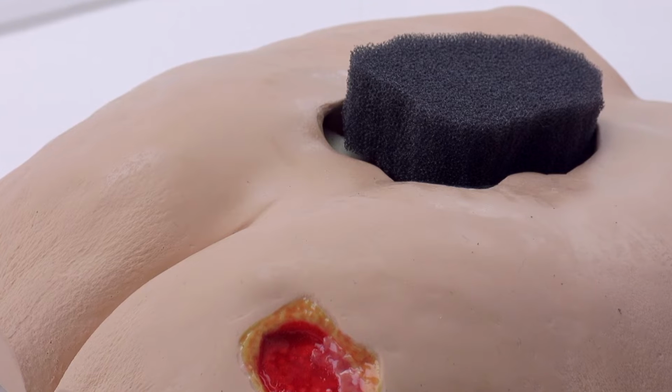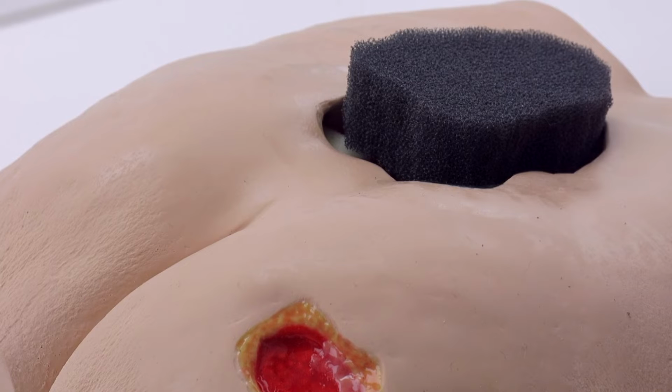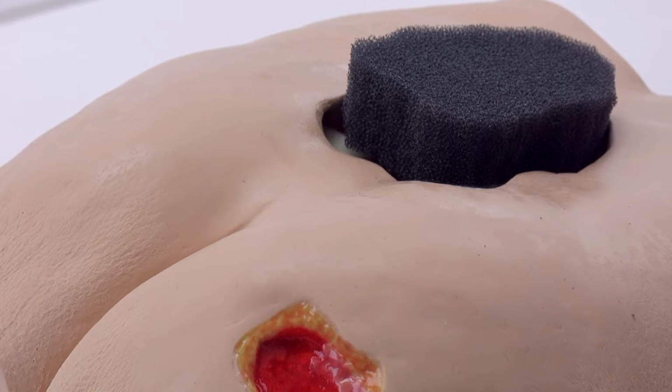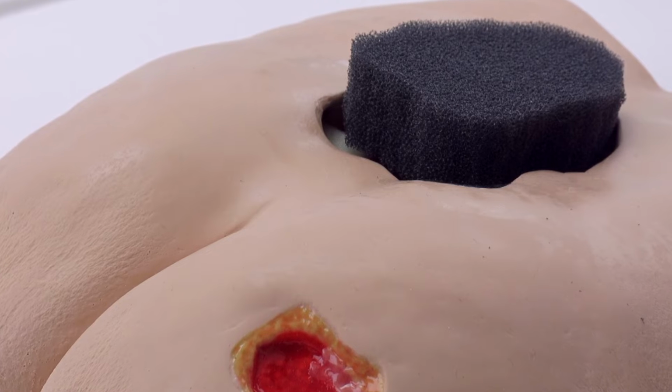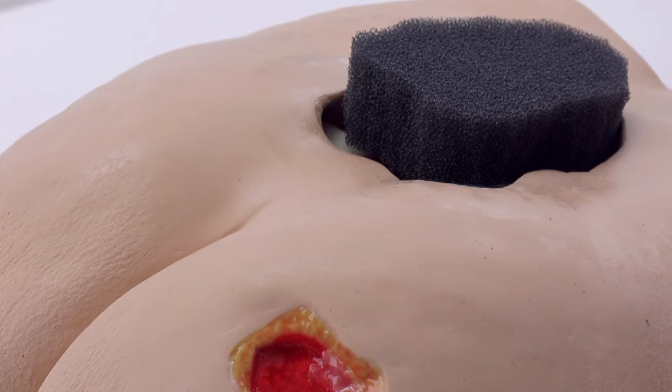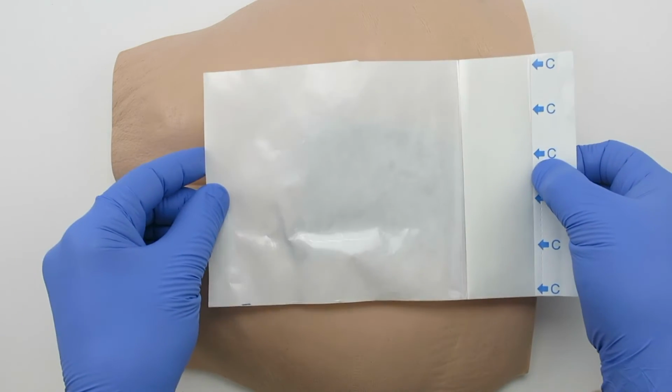Foam should be higher than skin level. It is not recommended to thin black foam. Thinning may cause overcollapse and prevent fluid from moving away from the wound base. If the wound shape is irregular, consider applying drape to the skin edges to protect them from the foam. Once the wound is properly filled, cover with drape.